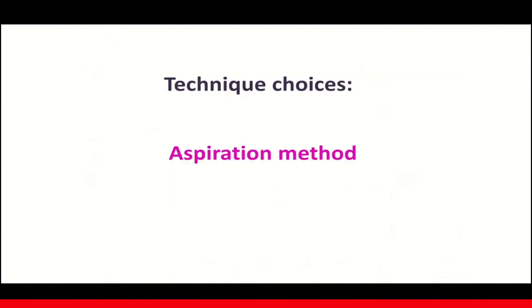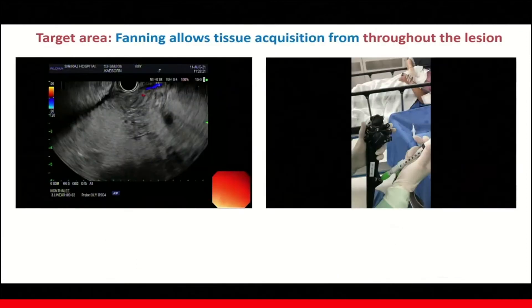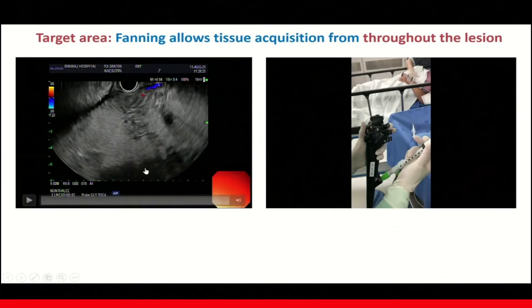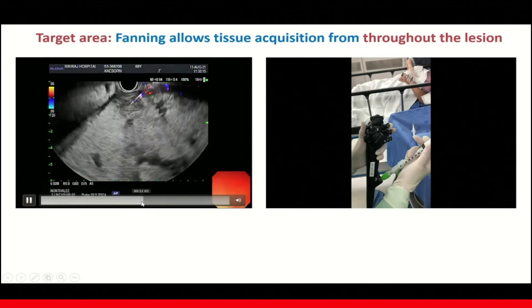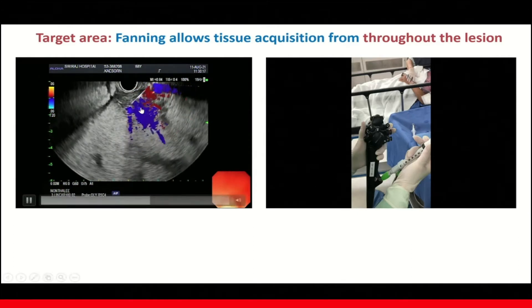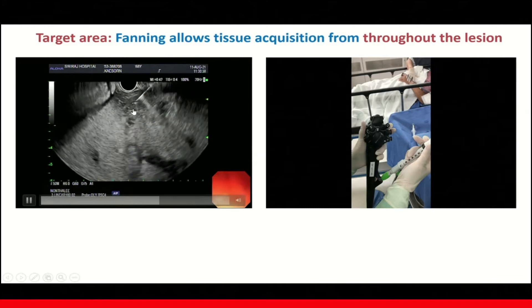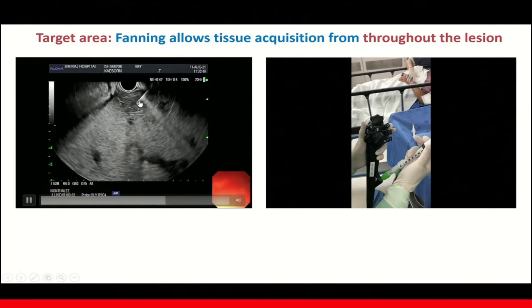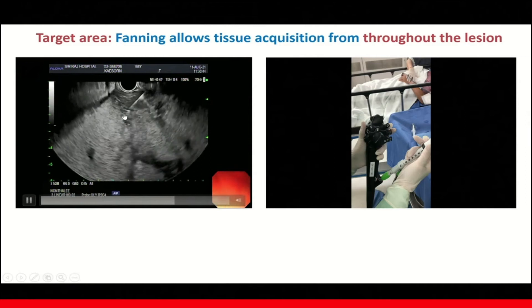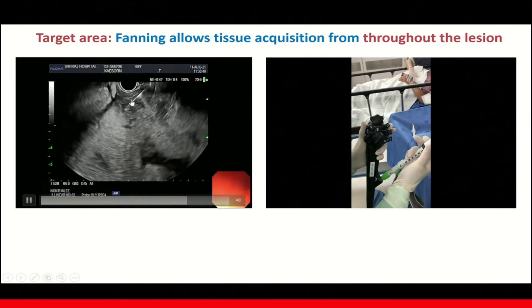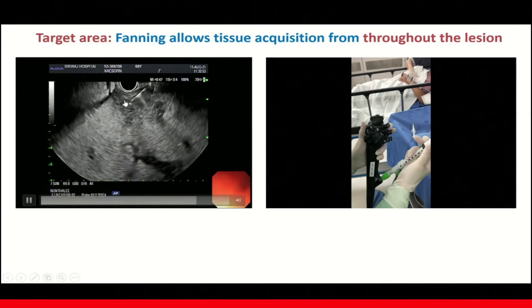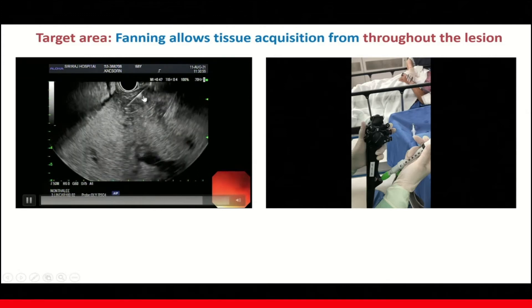Let's start with the aspiration method. The fanning technique allows tissue acquisition from throughout the lesion. Here's the video demonstrating the fanning technique, and here's the target lesion. With the fanning technique, the needle trajectory aims at different areas throughout the lesion, and you can see that the needle is puncturing through a random area depending on how you control the needle.